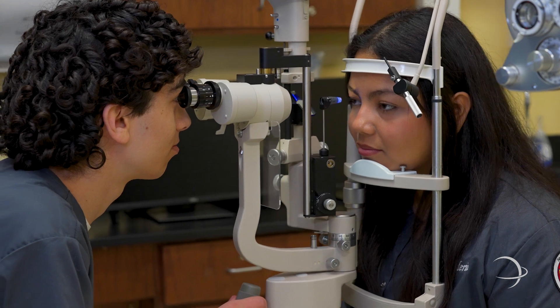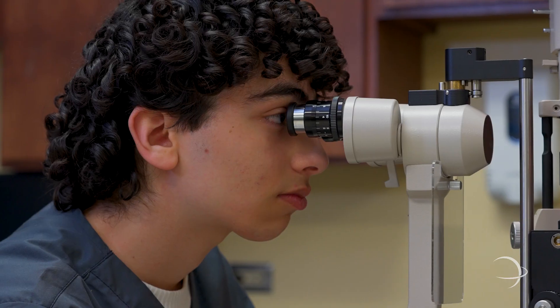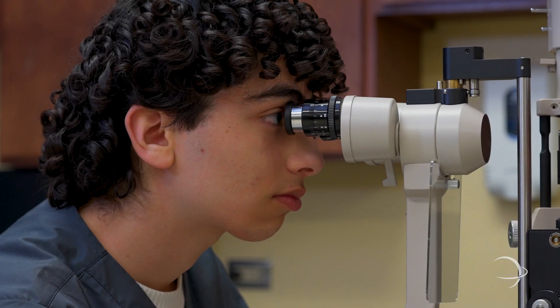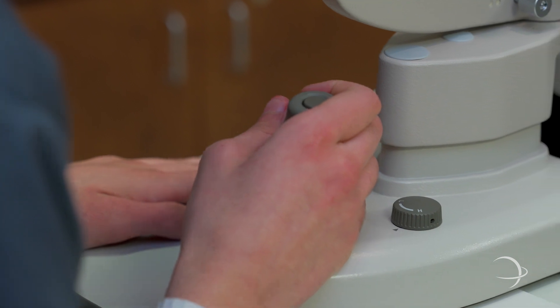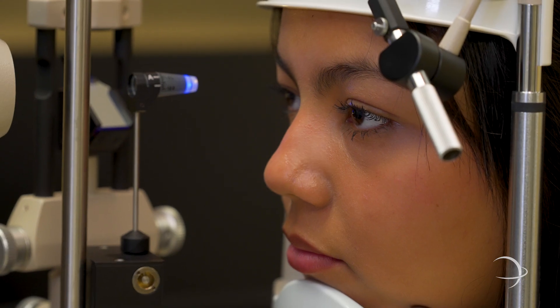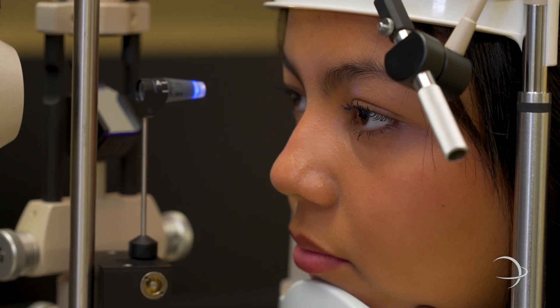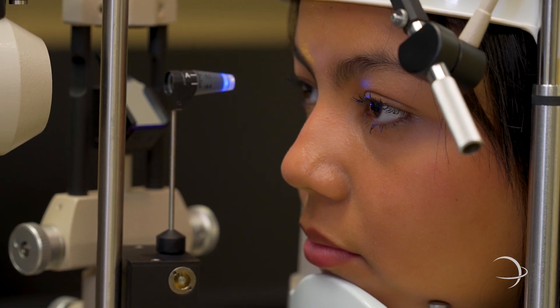As you see on our right, we have two students. At the moment, the student is looking into the eye to determine if there is any cloudiness that can be found and reported to the ophthalmologist. The ophthalmologist then comes in and does a full assessment.